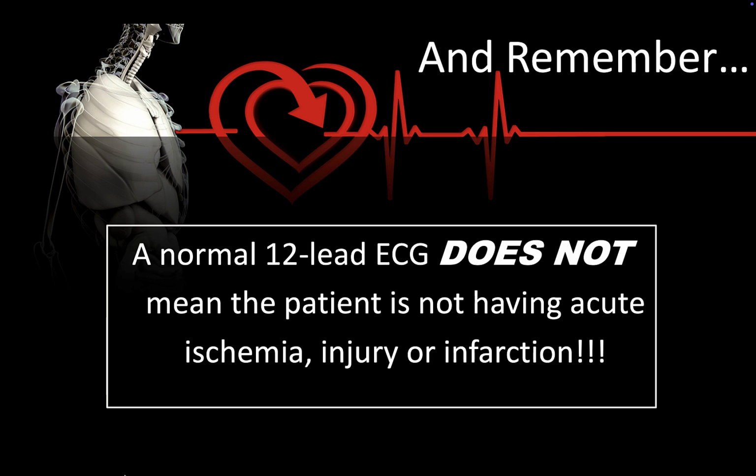Remember that a normal 12 lead does not mean that your patient is not having acute ischemia, injury, or infarction. And I'll say that again because this is important. We use the 12 lead because it is a very definitive diagnosis when it hands us that diagnosis on a platter. But not all MIs are going to produce ST elevation. Not all MIs are going to produce ST elevation early, even if they produce them later.